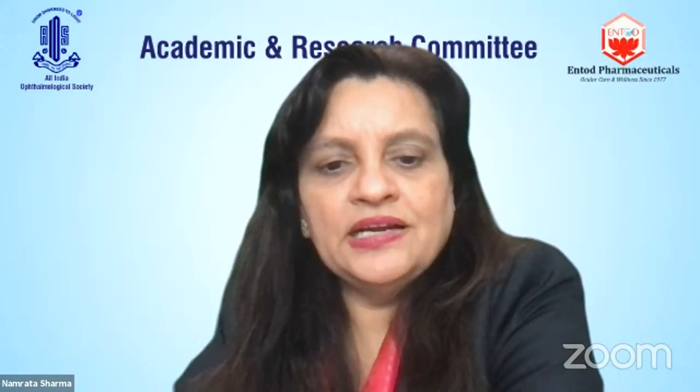Even with all the planning, you never get to emmetropia; it's always a little on the hyperopic side. That is one issue with RK, and most of them have high myopia. So all the features of high myopia, like a floppy pupil, and the cataract being harder than your red glow would suggest, apply. Polishing has to be done meticulously, because these patients tend to be younger. Yes, all those features of myopia would be there.